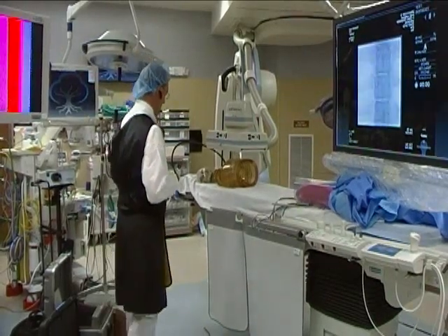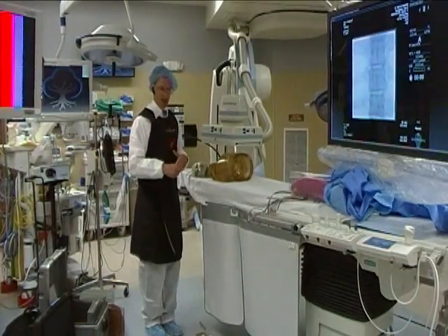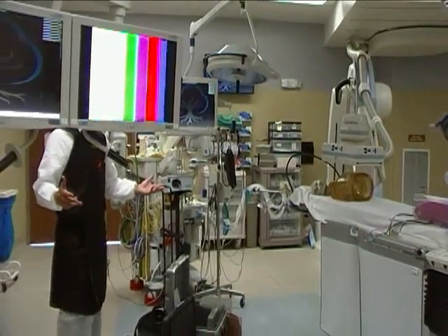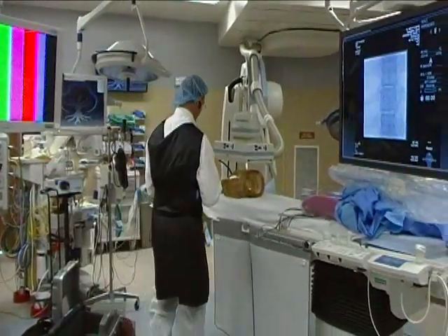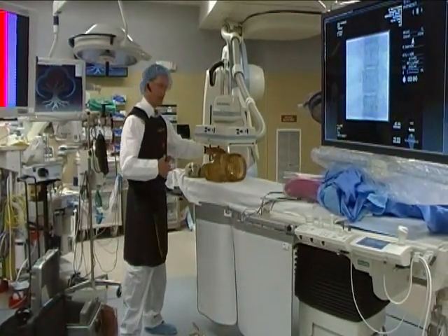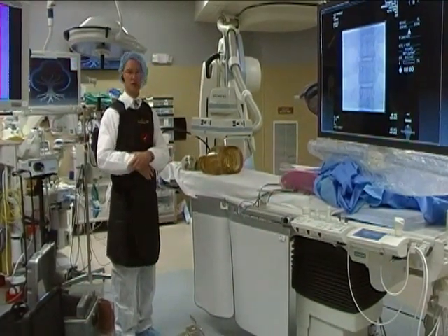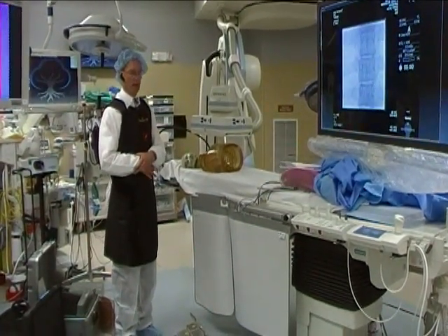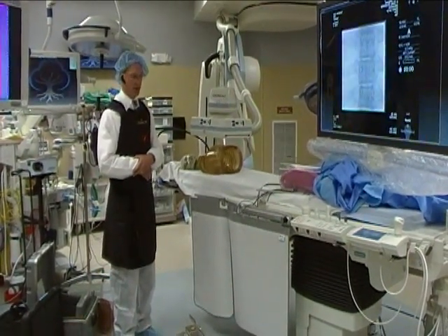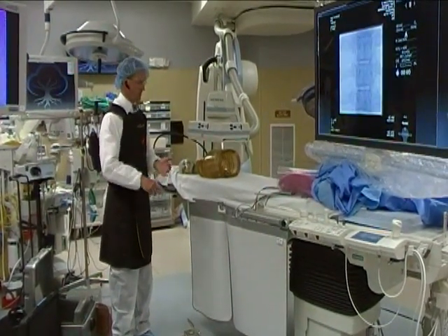So it's the people who are working directly on top of the patient who are going to be getting the high doses. As you move further out to these areas out here, you're getting very low levels of radiation. The state laws require that anybody who is within 6 feet of the patient has to wear an apron. That's because of that principle I just explained there. I think that's it on time, distance.